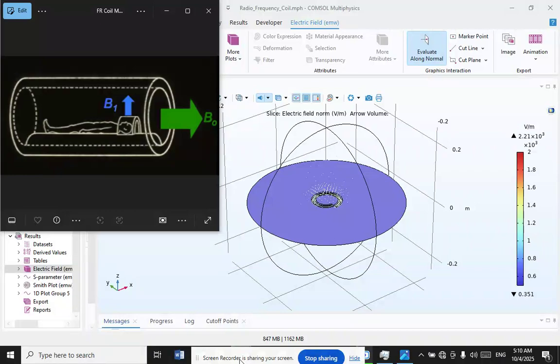When used as receivers, RF coils are responsible for detecting the MR signal. The oscillating net magnetic flux from the excited spin system can be captured by the coil, in which an induced electric current is generated. This current is then amplified, digitized, and filtered to extract frequency and phase information. Today, RF receive-only coils are often collected into large arrays for use in parallel imaging applications.